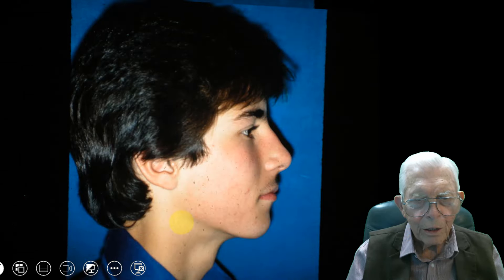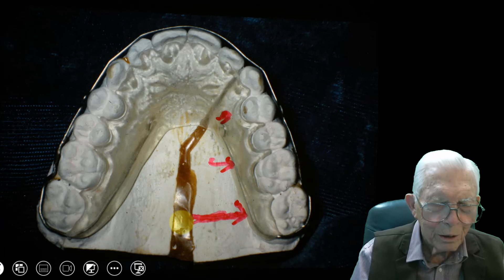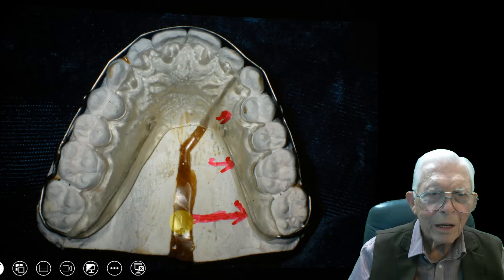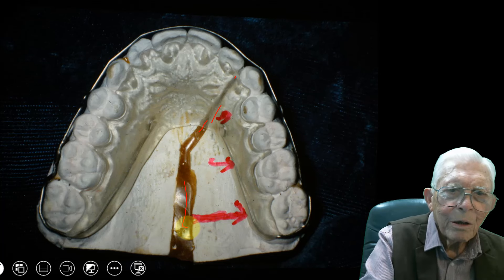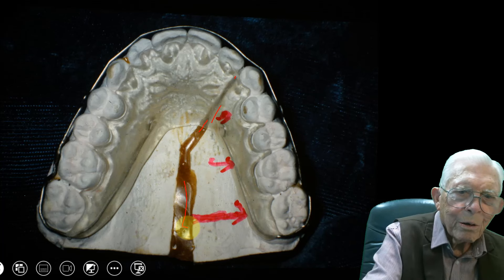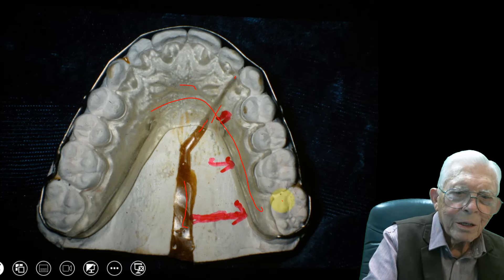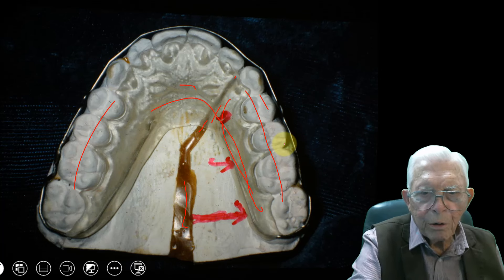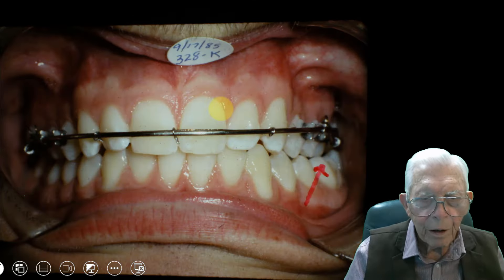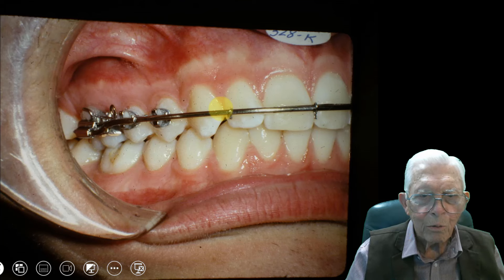So we ended up with the guy — this is after he matured a little bit. Before we had these acrylic aligners, we took this model, cut through it, put it together, took an impression of that, and made a retainer that would fit in there — and it's clear. This is what Invisalign could do for you now. We took this section, moved it forward, and closed that gap. We wired that, pulled it in over another wire, and it lined that tooth up in pretty good shape with a large wire on the outside.